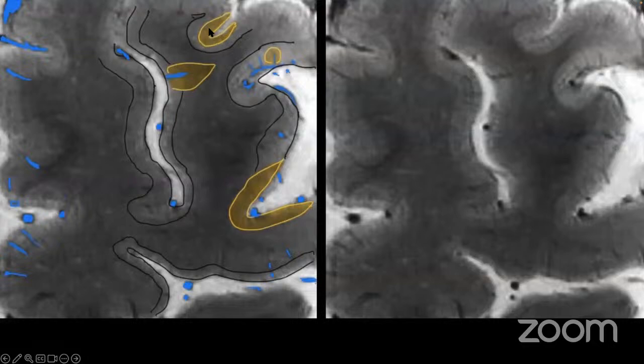So it's just spreading over distances, particularly over the sulci, and not reaching the full thickness of the cortex, and definitely not reaching the white matter. This is the most common one, and again, one of the least visible lesions. It's difficult to see this pattern of demyelination on the MRI.